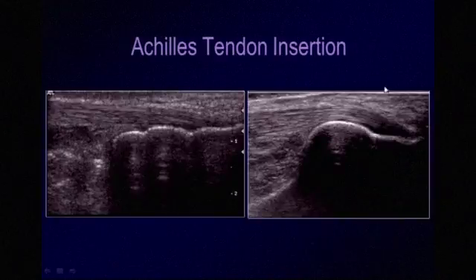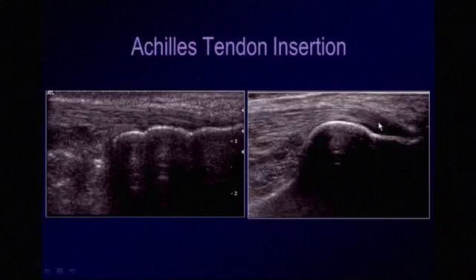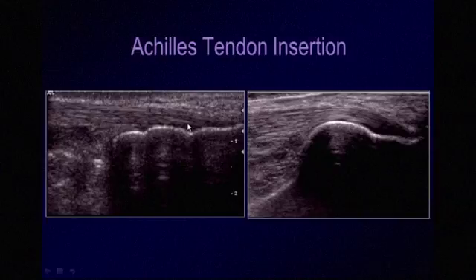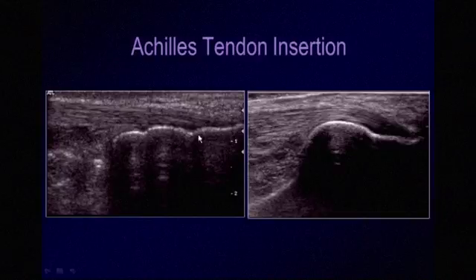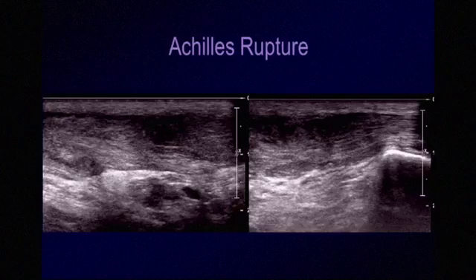Distally at the insertion, we may see an area of decreased echogenicity in the tendon which is due to anisotropy. To prove that this is not pathology, we would reorient the tendon by flexing or extending the ankle, or reorient the transducer to bring those fine parallel echogenic lines into view — perpendicular to the beam — and increase the echogenicity in that area of the tendon.